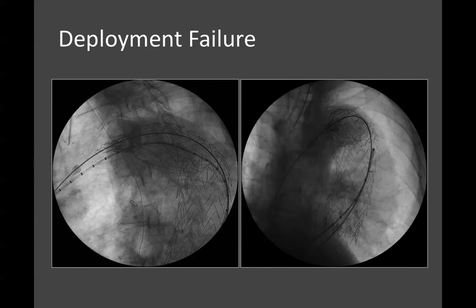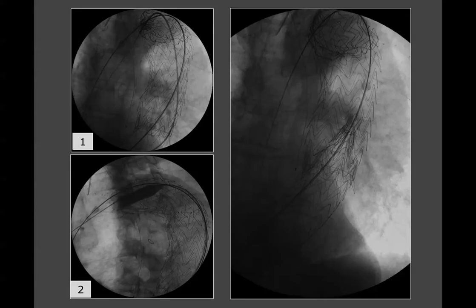What to do with this? Well, I guess you could do a thoracotomy, call the cardiac surgeons in, and take the thing out. That's clearly not an ideal situation. So using conventional endovascular techniques, we were able to sneak a 014 wire right through this, just to give you a sense how tight that space is. A 014 wire barely went in. We went in with a 2mm coronary balloon, barely got a little space in, exchanged it for a 035 wire, etc. And eventually, with a 12mm double XL balloon, inflated to about 10 atmospheres, we were able to break the string that was constraining it.